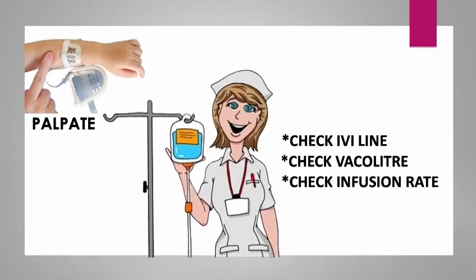Once you are sterile and protected, proceed to palpating the incision site for tenderness. If the site is wet, dry the site with gauze. Report any abnormalities you find to the sister. This is done to exclude tissue injuries.